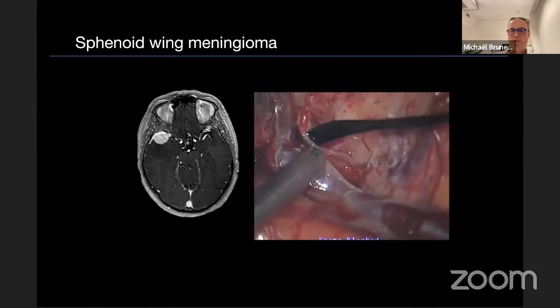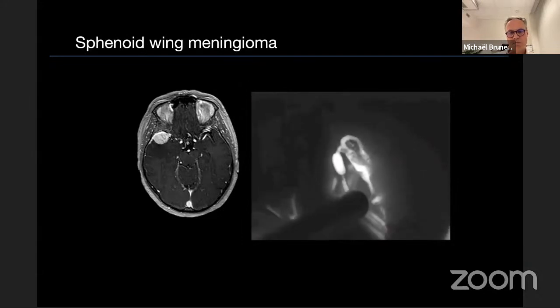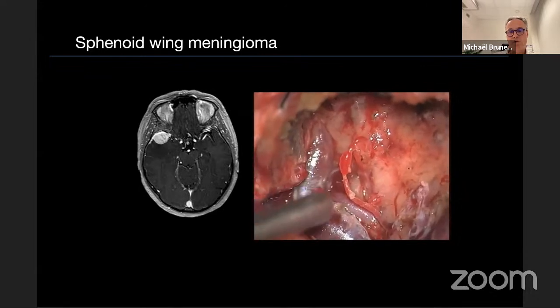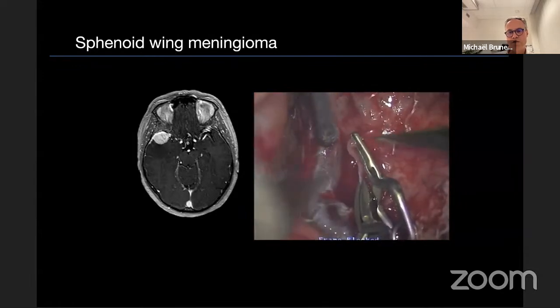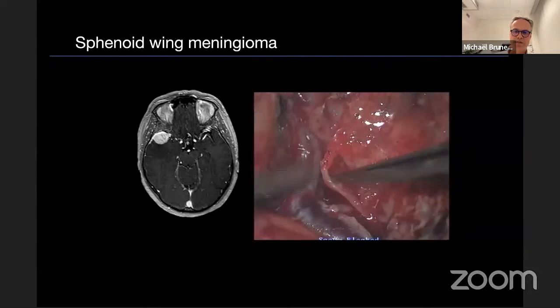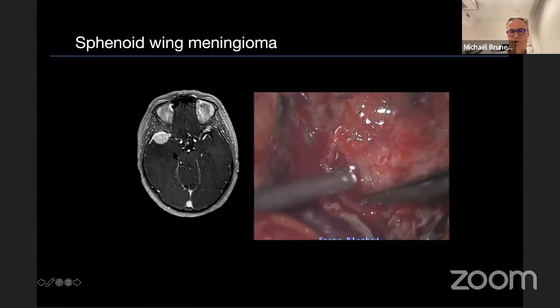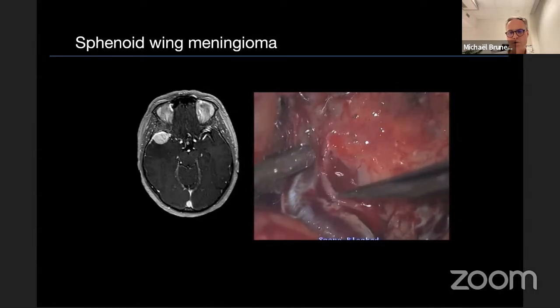The time I asked myself what to do, the vessel spontaneously ruptured. It was patent. So in order to have perfect control of the situation, finally, we have no other choice than to repair the vessel, placing a clip, you will see, on the vessel, and then suturing the vessel in order to leave it completely patent. I was surprised that before operating this small tumor, it would finally end with a more complex surgery, but you also have to be prepared for that.